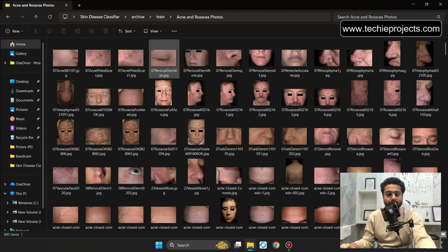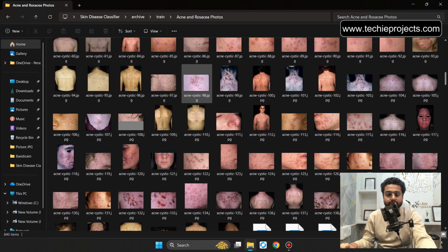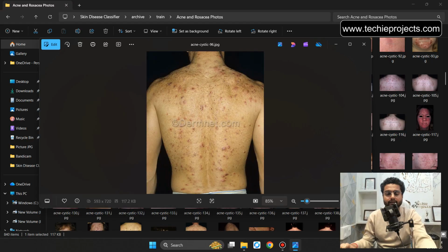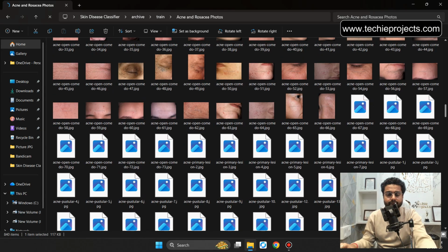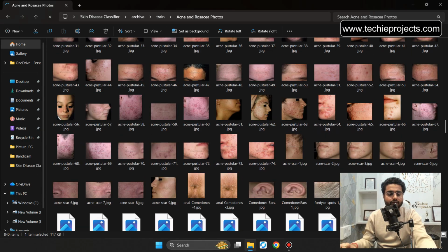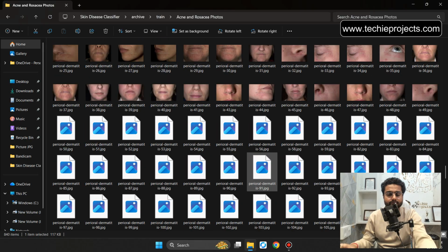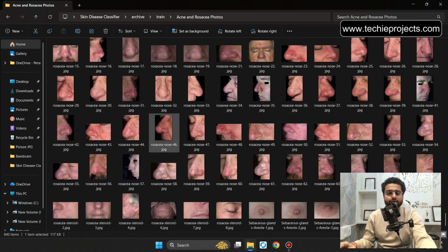Let's open the folders one by one. Now those are the acne and rosacea photos. This is the type of skin disease. Let's open any of the images. That will be a particular type of disease. We have to identify it from that particular software. So a total of 840 images are there. We have to identify those.